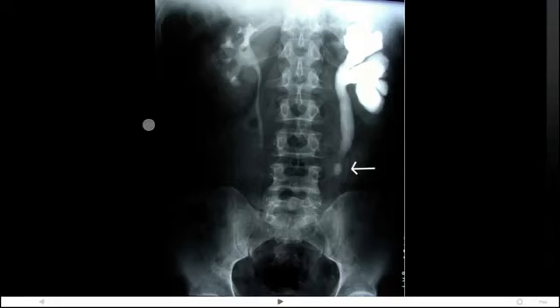This will also often involve the injection of contrast to create an intravenous urogram, in which case a number of films will be taken. A film immediately before the injection of contrast, called the control, a film taken immediately after the injection, at 20 minutes, at 60 minutes, and pre and post micturition.